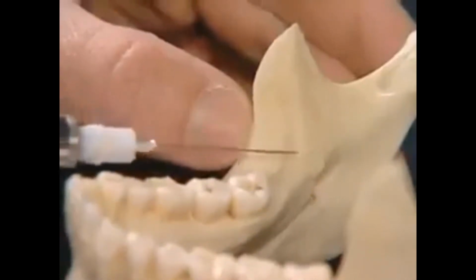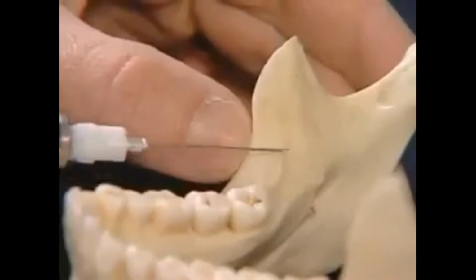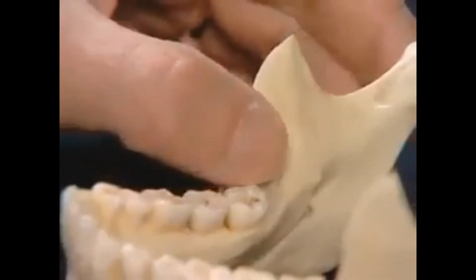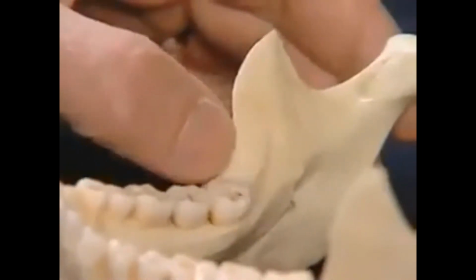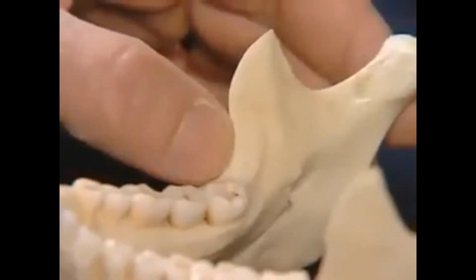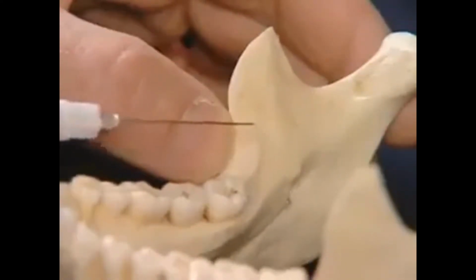The next stage is to palpate the internal oblique ridge, which is the next prominence as you move your finger or thumb in medially, and that should be palpated, a mental note made at that point, and then your finger or thumb again withdrawn laterally, pulling the soft tissue landmark with you. It is just medial to the internal oblique ridge that the needle will be inserted.